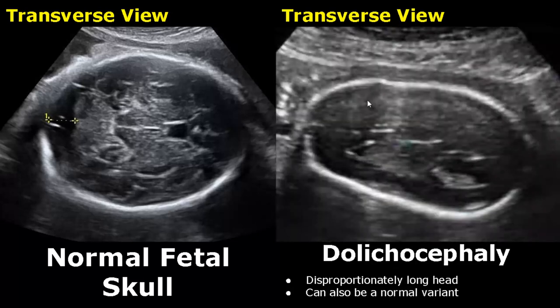Dolichocephaly is a disproportionately long head. You can see that the head is much longer than usual in this image. It can be a normal variant as well, but is also seen with breech presentation and oligohydramnios.